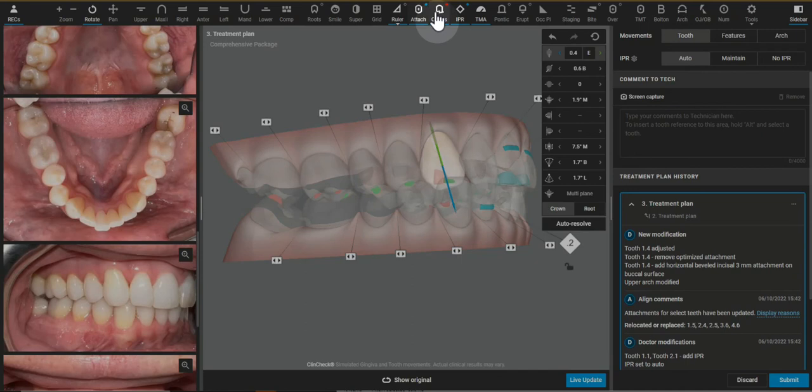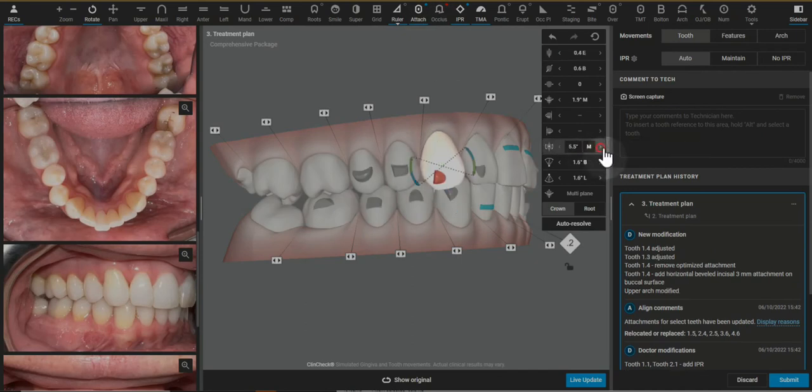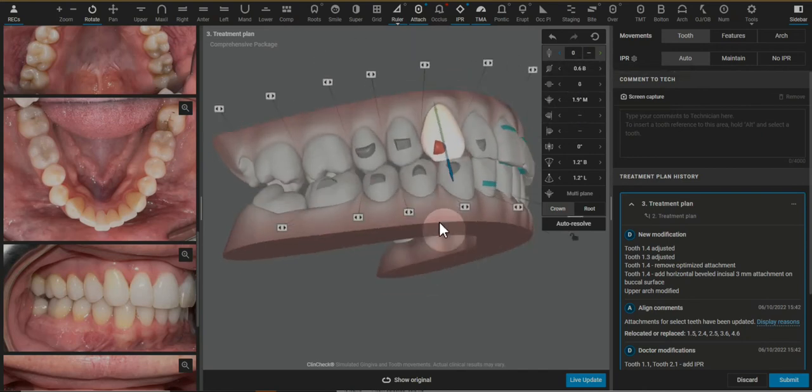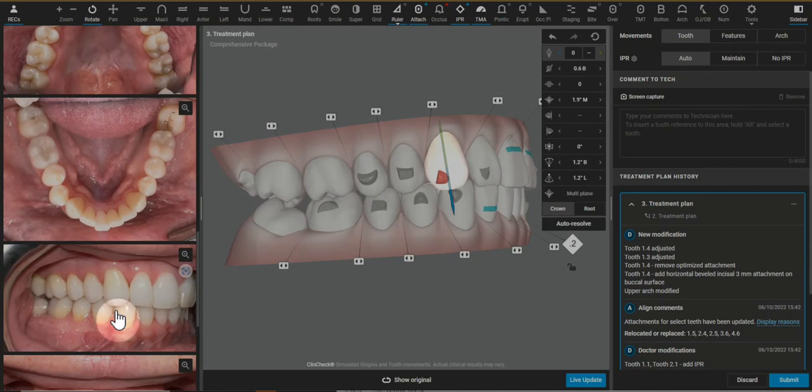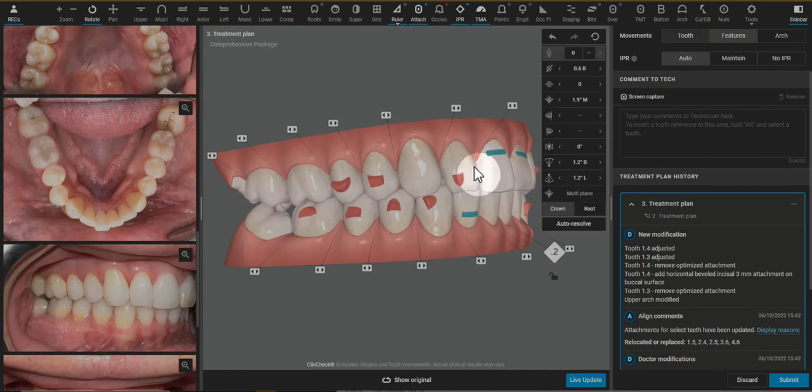I'm going to look over here — you can toggle down or I like to highlight, type in the number zero, enter, and just eliminate that way. So now we don't need this type of root control attachment. I just eliminated the extrusion because we didn't need to pull the canine further down on a deep bite case and the tooth isn't rotating very much. So we can go without that attachment.